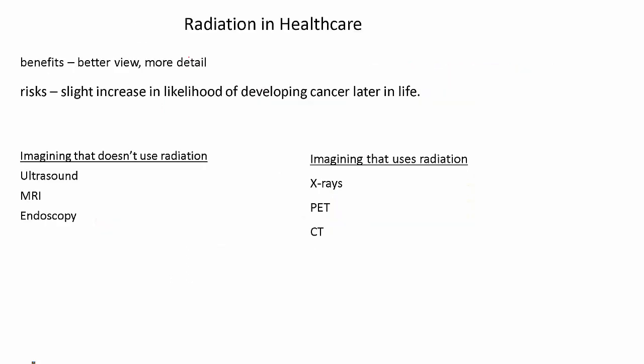Easy peasy. So a couple things to keep in mind as you are moving forward and looking at radiation in healthcare, because you as PAs will be dealing with a lot of imaging techniques. You do want to keep yourself safe and healthy and try to reduce the amount of radiation exposure. So some of these will be beneficial in that they don't use any radiation. For example, when you use ultrasound, easy peasy, no worries, right? You can use ultrasound all day, all night. The sound frequencies, they don't hurt a thing. MRI, once again, we don't have to worry about anything radioactive, nor do we need to with endoscopy.